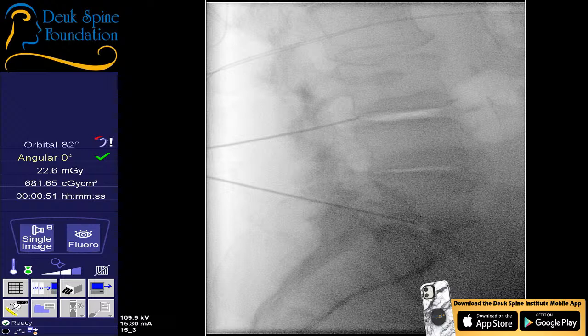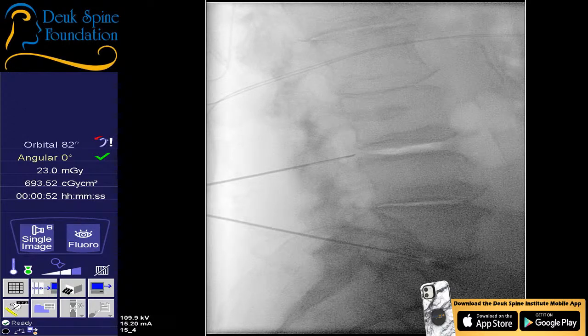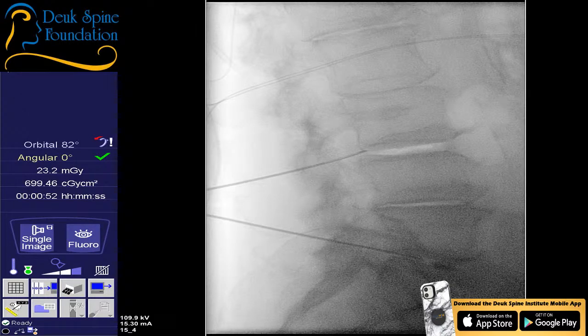So the bottom pedicle, the pedicle below the needle, is the one that's completely off. And that's why I'm having trouble. Now that's better. So I'm hitting the bottom of 3. That's the problem. I'm hitting the bottom of 3, end plate basically. I want to aim down. See if that makes it any better. Well, very collapsed. So I'm right there. AP. And I think if she was asleep, I could get in.